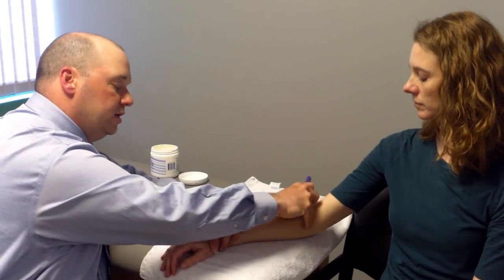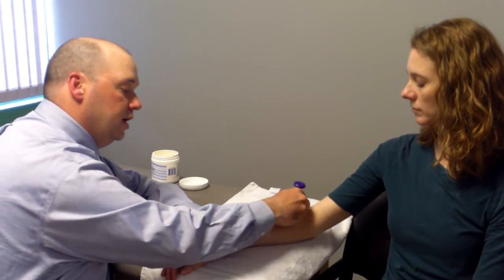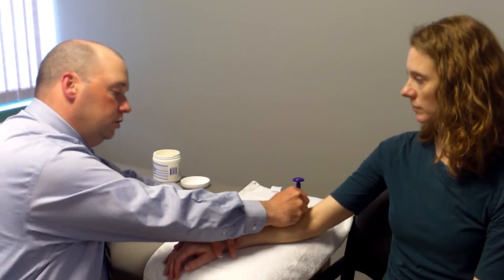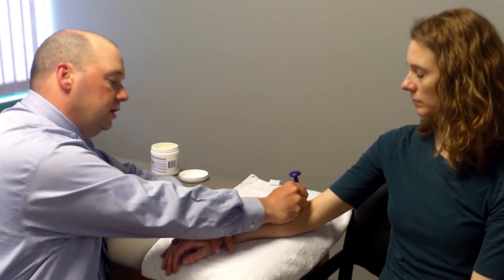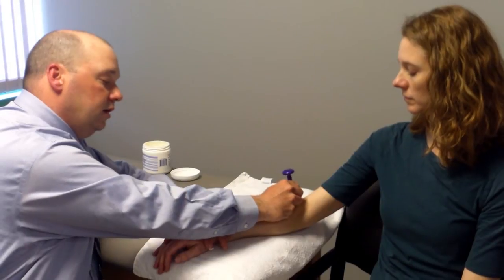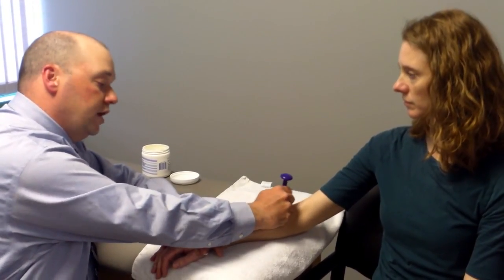And then as we want to get a little bit deeper, we can come in with this smaller tool and do a little bit of working across there, in a cross-friction nature, to break that area down. This area is a common treatment that we use in tendons that are chronically inflamed for tendonitis, like the lateral epicondyle here, or maybe the Achilles or plantar fasciitis. We also use this treatment technique for post-surgical scars and typically after those kinds of injuries.